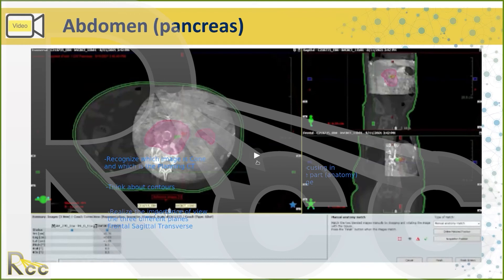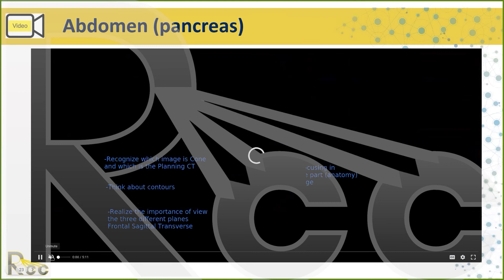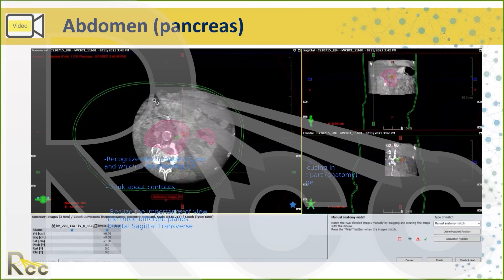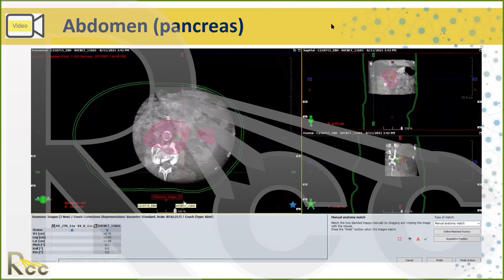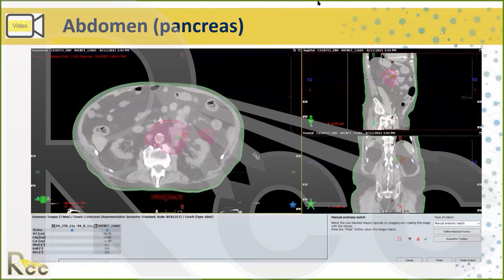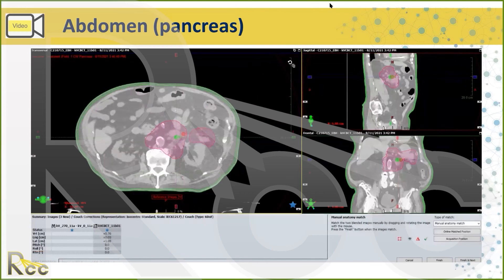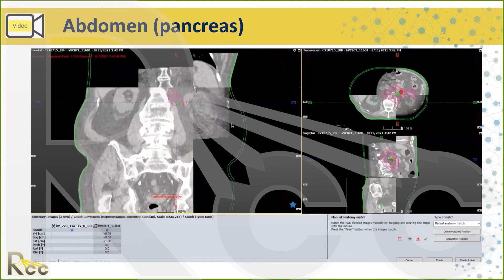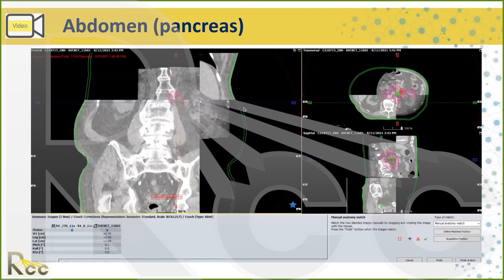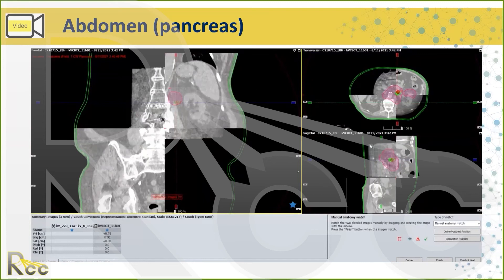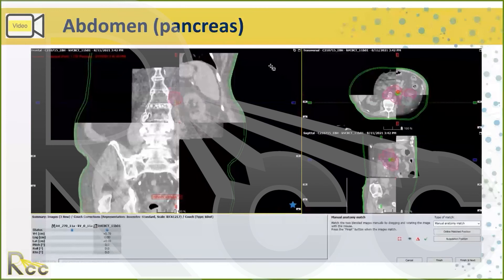This is a video I made about how to do image matching — I'm going to play it with sound. This is a pancreas case. We have a spotlight cone beam — notice the small field of view. Looking at the planning scan, you can see the bony anatomy is off quite a bit — the spine is off. The pink area is the target. I'm going to go to isocenter and switch my views to make sure the spine is lined up in and out first. Using my preferred tool — the checkerboard — I can see how far off we are left to right. I'm going to start with bony anatomy and look at another view to confirm.